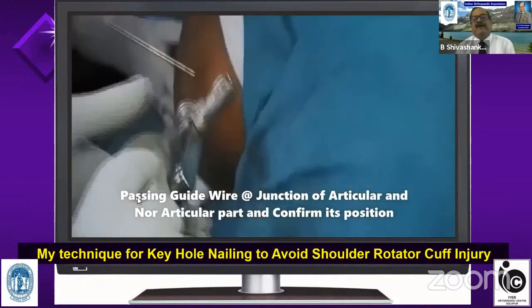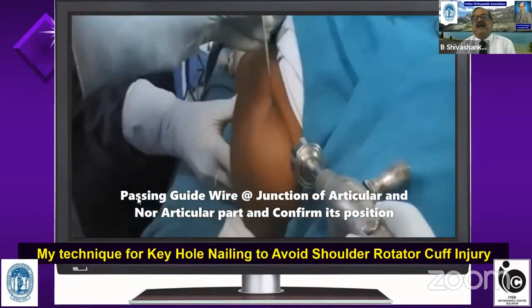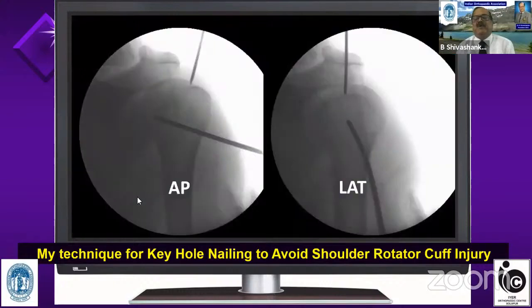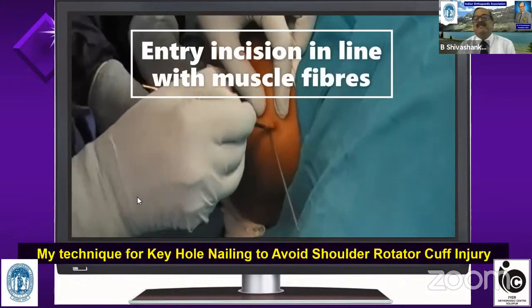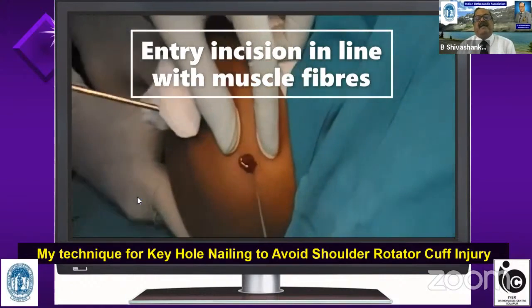This is a 1.5 millimeter K-wire which is used for a 6.5 millimeter cannulated screw. I pass it in the center of the proximal medullary canal and I confirm it in both AP and lateral pictures. Then only I will drive it more distally. So I am confirming that my guide pin is at the junction of the articular and non-articular portion. Now I am seeing that it is entering into the medullary canal. Then once that is confirmed, I take a small 8 millimeter incision, a very small incision.